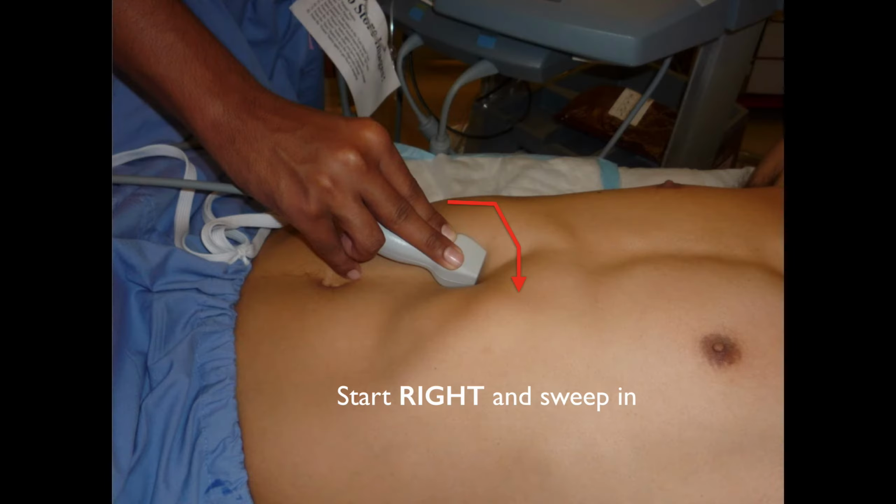So the reason, we talked about the subxiphoid view being called the subhepatic view, and sometimes it's difficult for people to get. So what you can do is start on the right, find the liver first, and then sweep in the middle to find your subxiphoid view. Sometimes that's the easiest way to look for it because you have to go through liver.